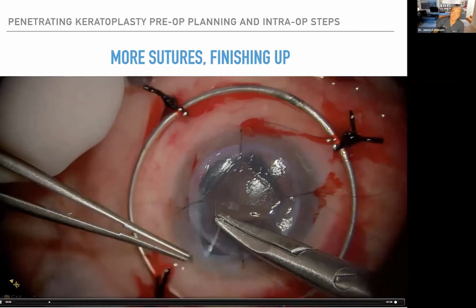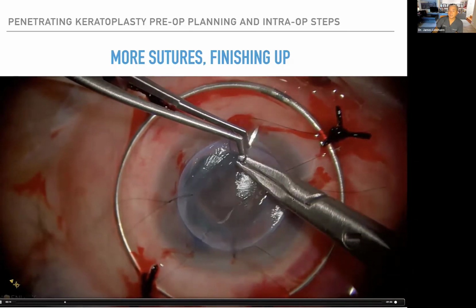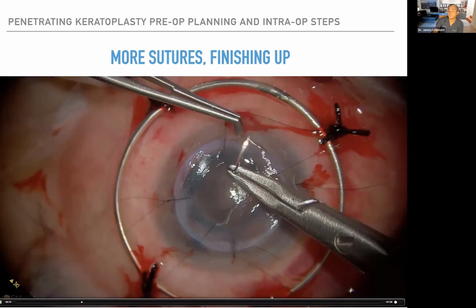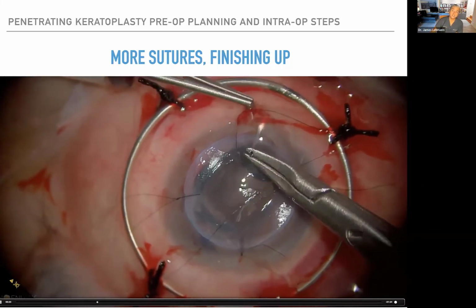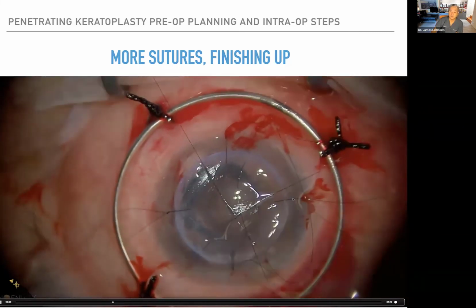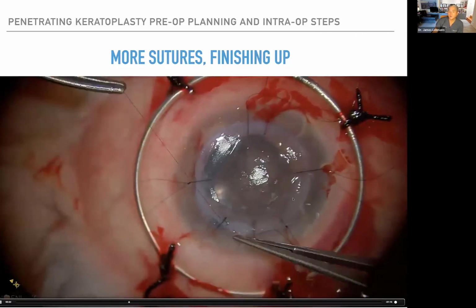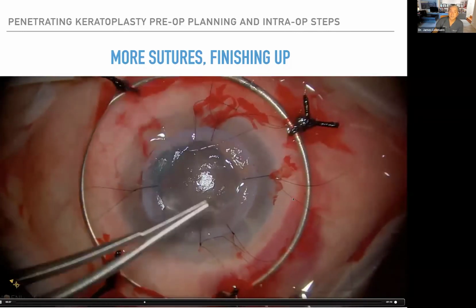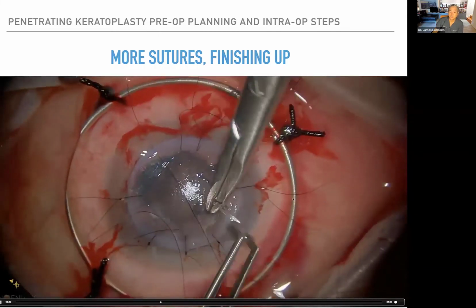Or you could do 16 interrupted. It's what you want. But you can see here I'm not tying them after each pass. This is the critical part that I'm showing. Since the cornea is stable with those 4 cardinal sutures, now you can pass sutures and just cut them. You don't have to tie them, so your assistant. You end up with a little bit of spaghetti on the cornea. So this is 20 times speed, so it takes longer. And then when you have to get a new suture, as the assistant is loading the new suture, then you pass and tie. So we're going to end up getting 12 sutures here, so 2 more.